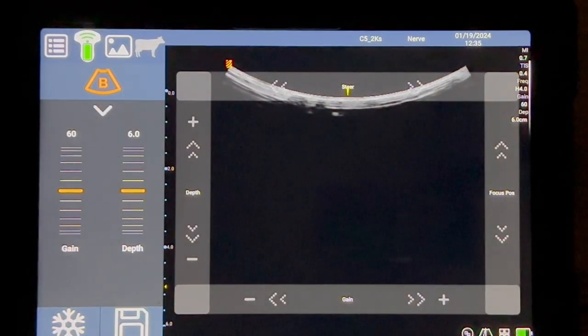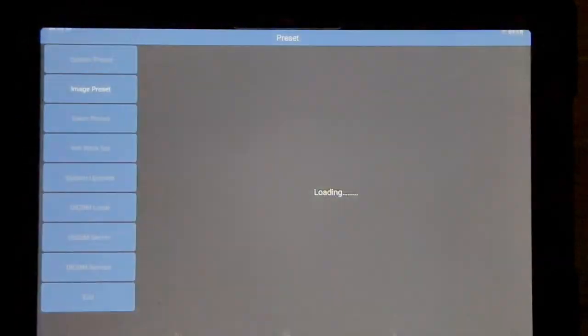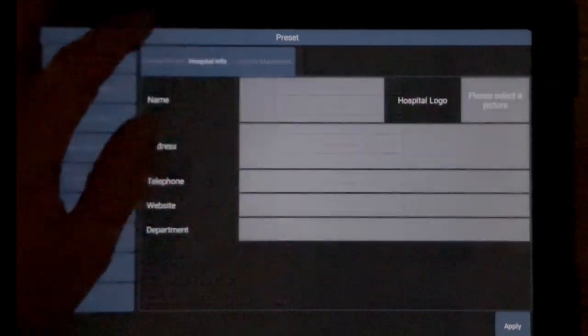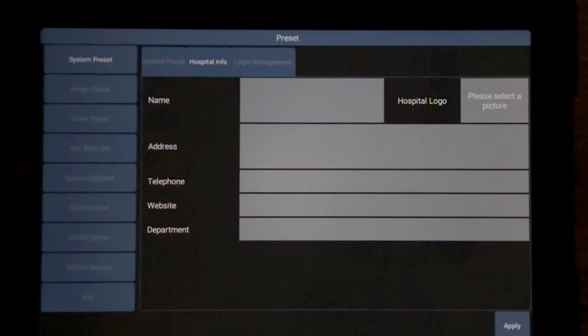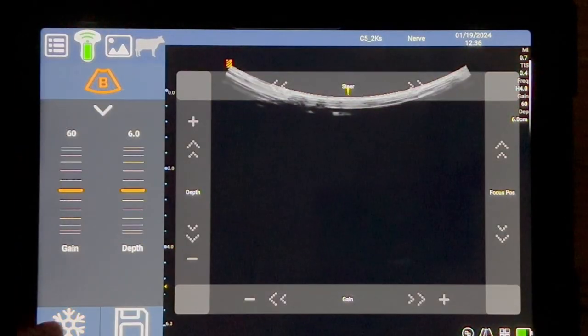If you want to do your own settings and set up your own presets, just go across to options and then preset, and here you can set up all your pre-settings for the device. You've got your system parameters if you want to change your language or the channel select, change the orientation, or disable the probe buttons — meaning you can disable the buttons on the actual physical device. There's also a cool branding feature: if you want to send a report and you are branded, you can actually upload your own logo onto reports and add all your information so it generates onto any reports you send out to patients or vets.